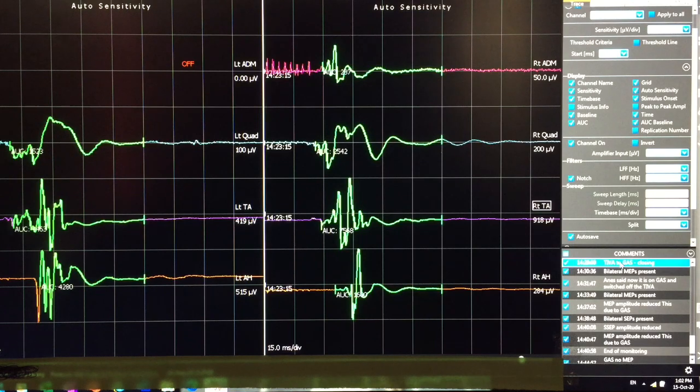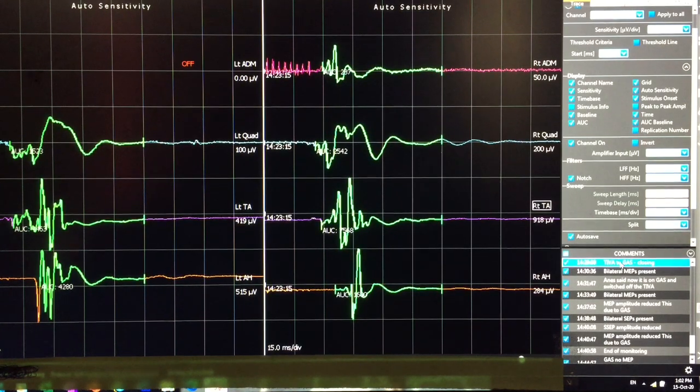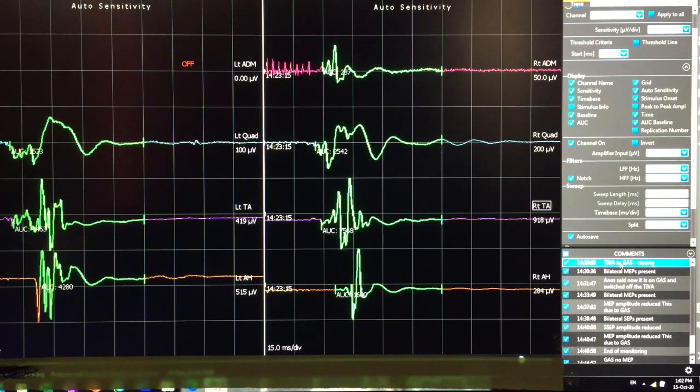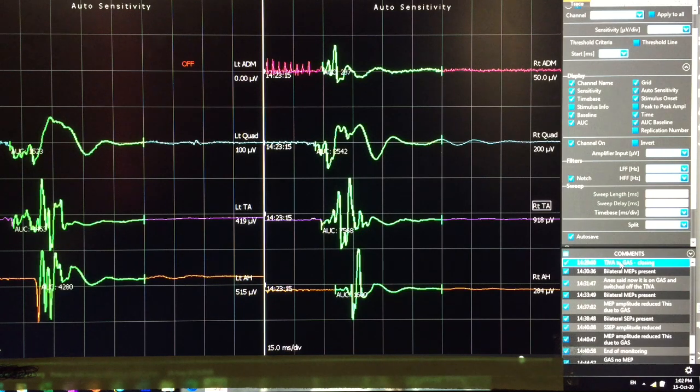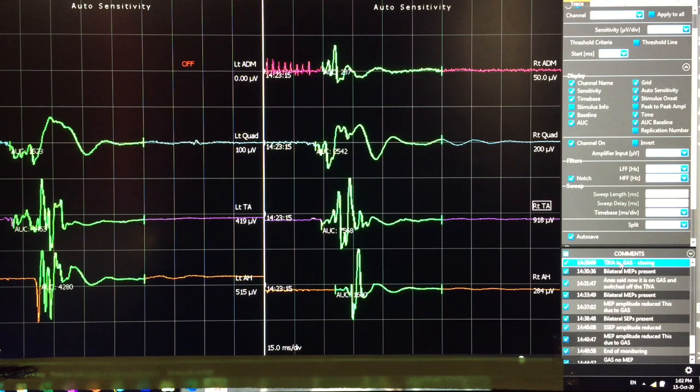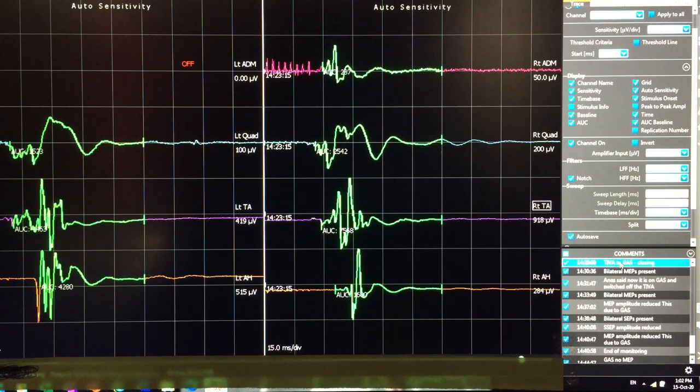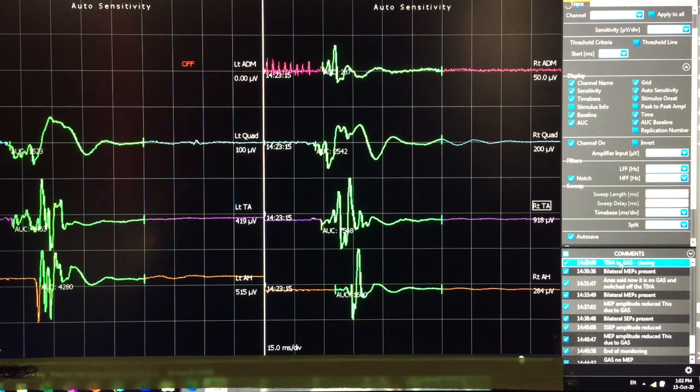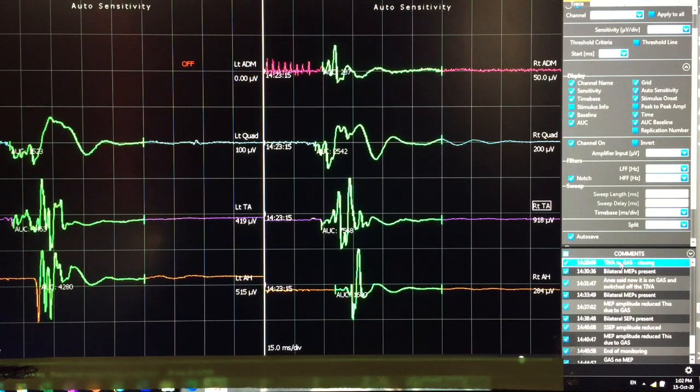Now I am going to show you how the MEP responses are affected and how quick you can see the changes. So as I said, this is before switched off the TIVA. You can see very good MEP responses from all the channels.